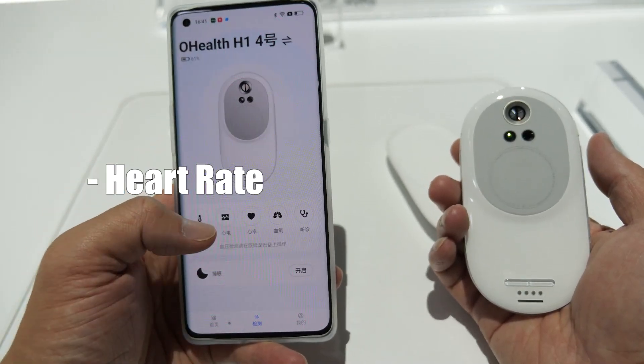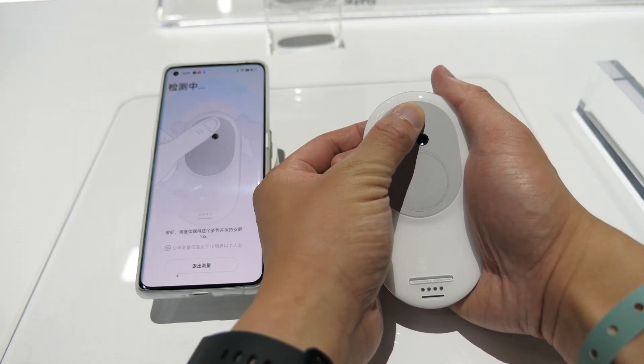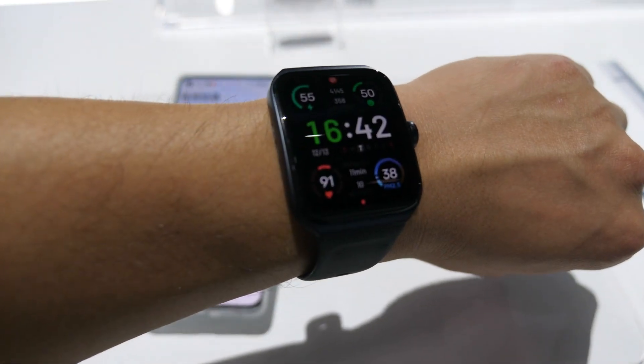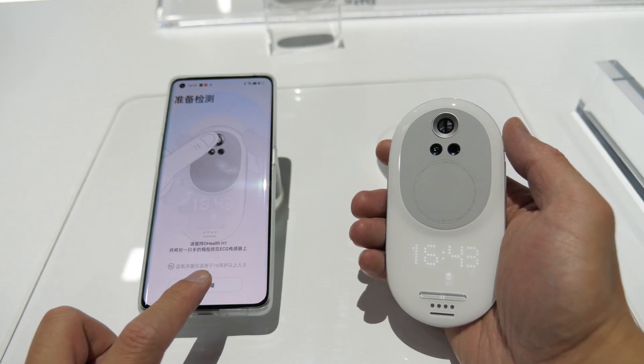Here is the heart rate — let's try heart rate. So the same as the open watch 3 pro, okay, 91. And then this is SPO2 — I guess it will be the same way.